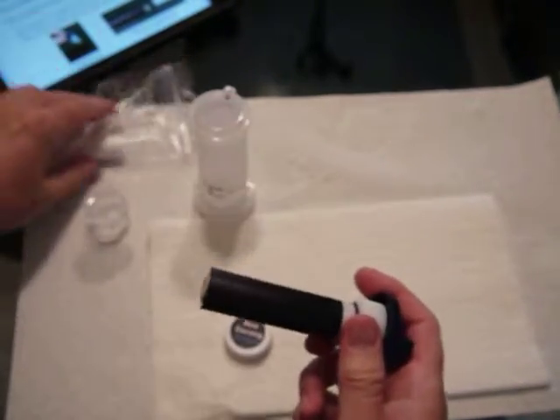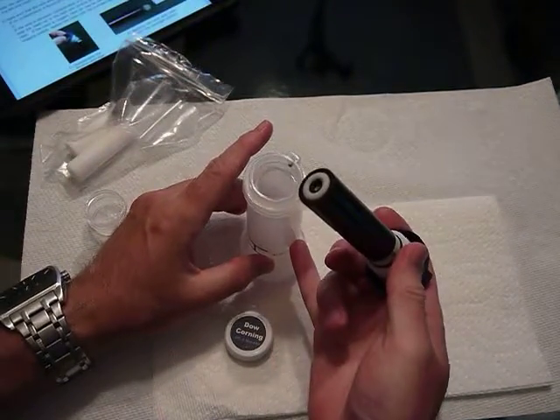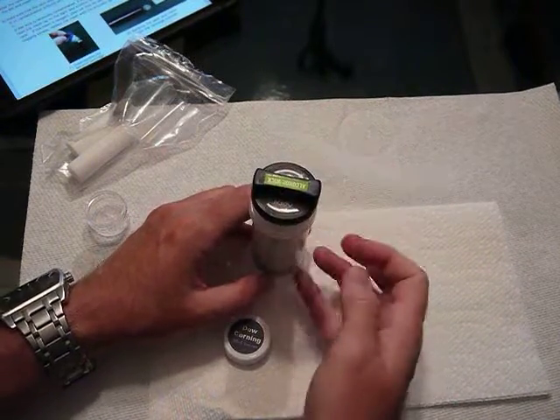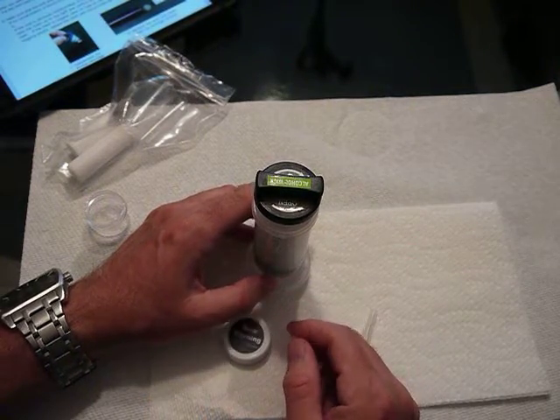And if I had put in a new piece of felt, I would put in fresh alcohol, especially if this alcohol was contaminated. Then I would let this soak for probably 10 or 15 minutes to allow the new alcohol to get into the felt, and then I could continue with my fit testing from there.